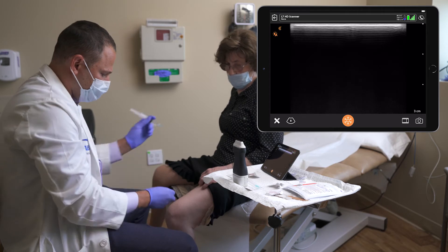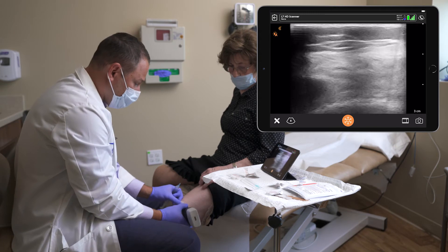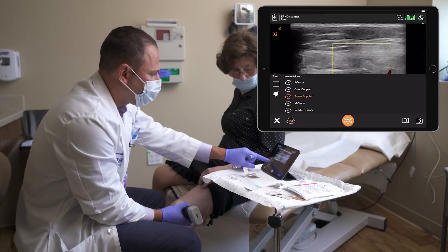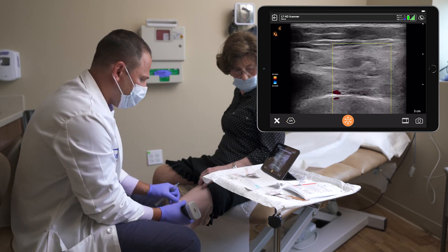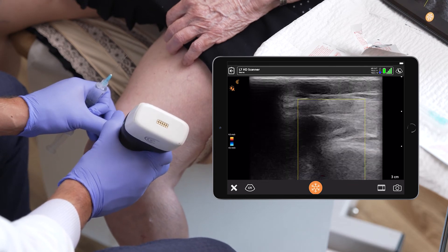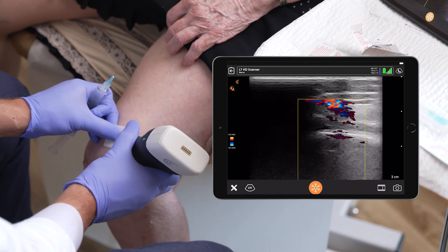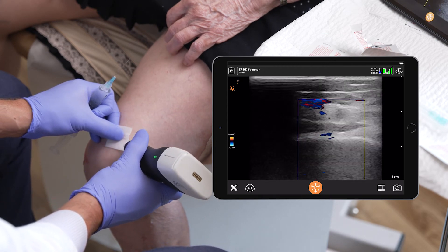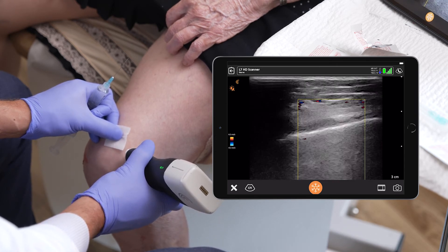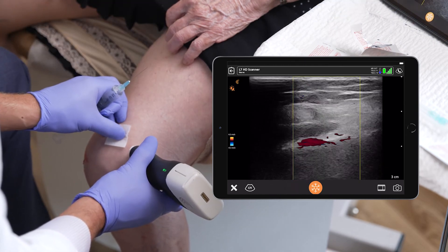Now we're going to scan for the lateral branch, which also runs with a blood vessel. I'm going to put my Doppler on as I scan for the blood vessel to help me isolate the nerve. I like to go as distal as possible on the epicondyle. As I'm scanning proximal to distal, I'm looking for the nerve and the blood vessel. Too much pressure and the blood vessel will disappear, so it's important not to press too hard.